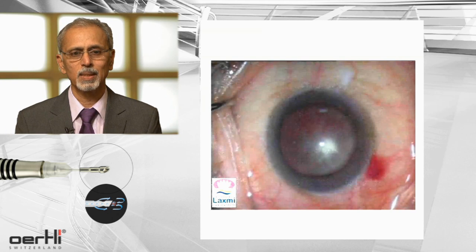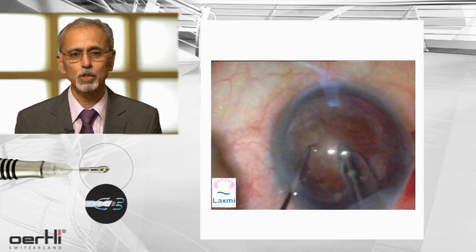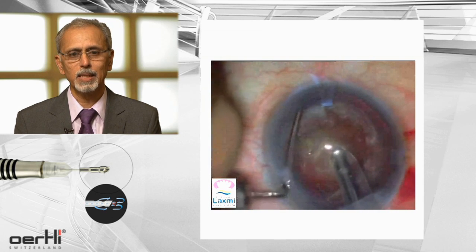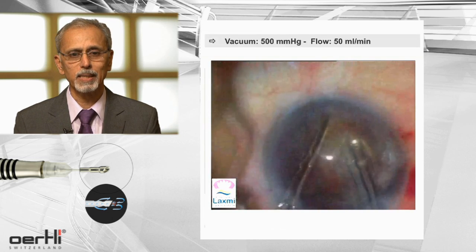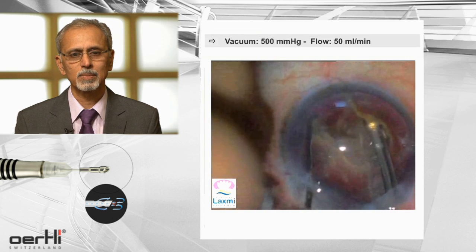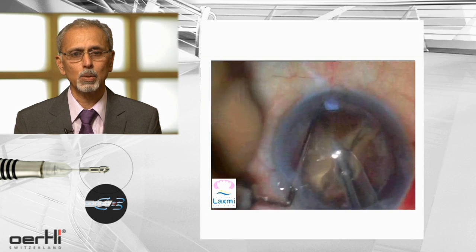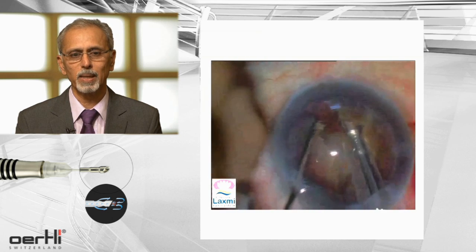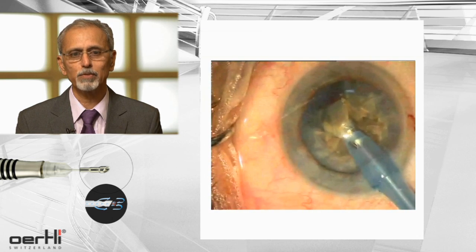This is one of those grade 5 nuclei. The nucleus is split with an EZ-Tip 2.8 and a blunt tip chopper. These cases are done with 500 vacuum and 50 cc flow rate. It is always a good habit to split it into as many pieces as possible. And now the last part — the gobble. To do this, I use a one-handed phaco technique.